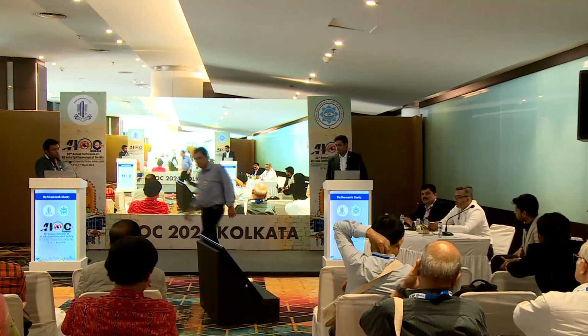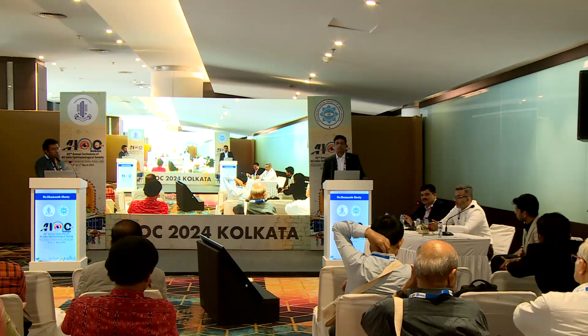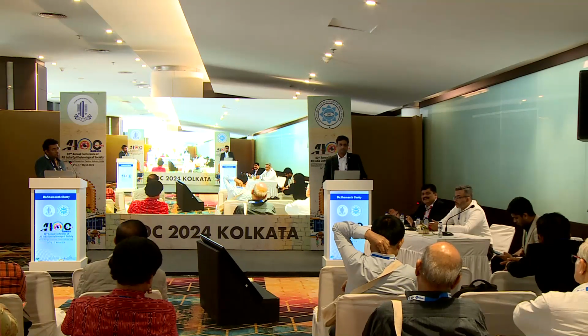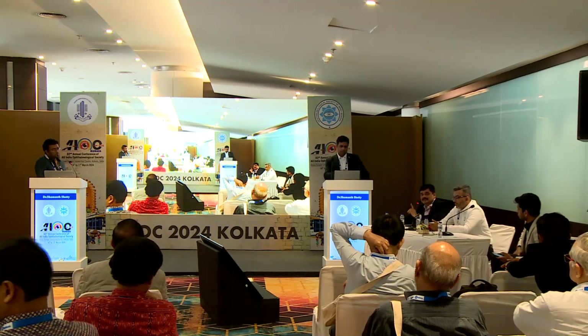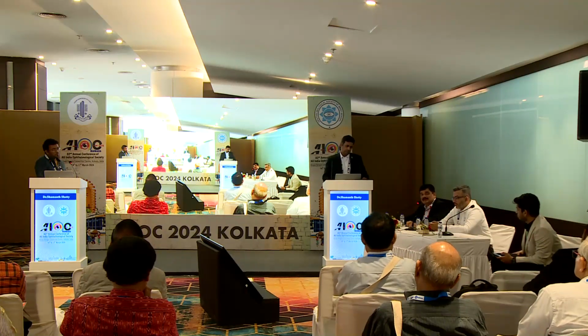Always you have to be dead on with the intraocular lens power calculation for the dominant eye. But in the non-dominant eye, there is some amount of tolerance for a decentered lens or any more rings even in the pupillary margin. The patient will not complain much, but you have to be dead on. That's why I even tried it in my mother.